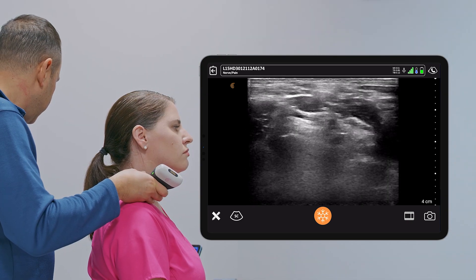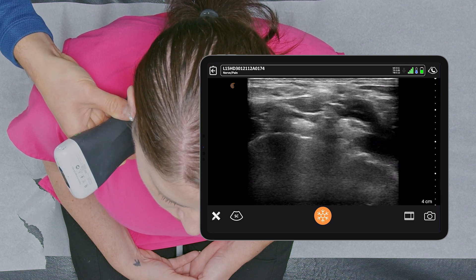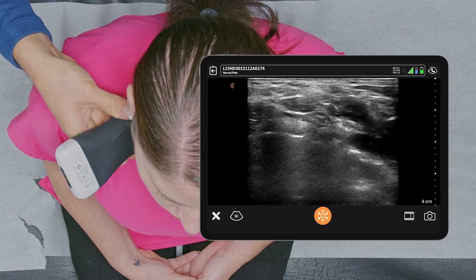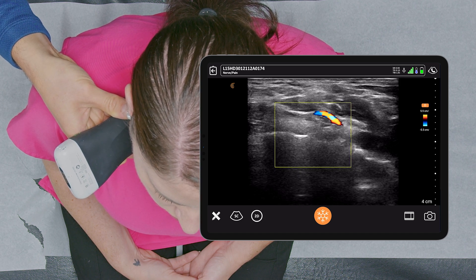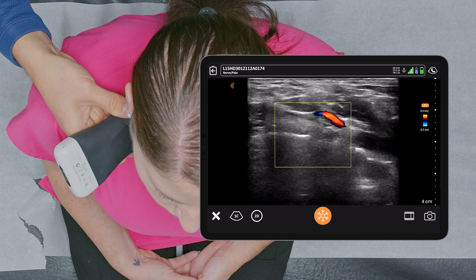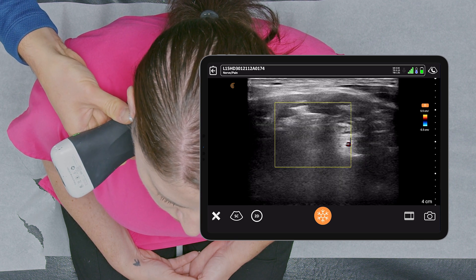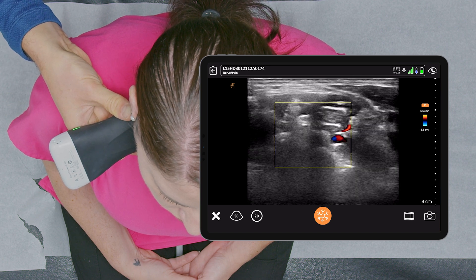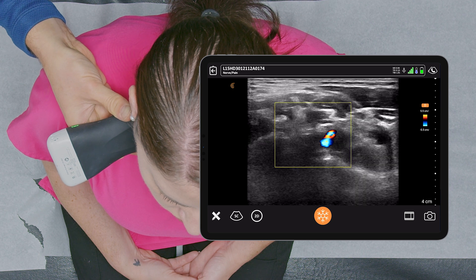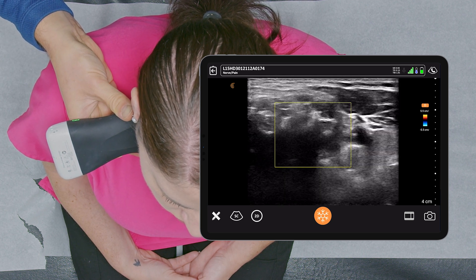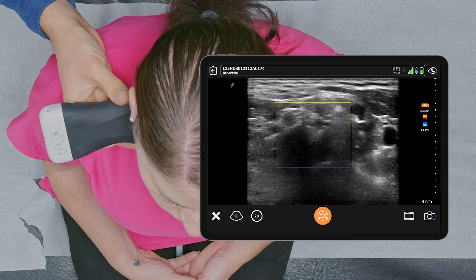I believe I've found the C7 nerve root because there's no real anterior tubercle to it. I'm going to identify the nerve in the center and make sure it's not a blood vessel. It's not a vessel, but there is a blood vessel above it — so caution, I am a little low. I'll scan superiorly. That's the vertebral artery, and it's going to come posterior as I ascend and disappear into the bony canal. At the level of C6, the vertebral artery goes posterior into the foramen as it descends.